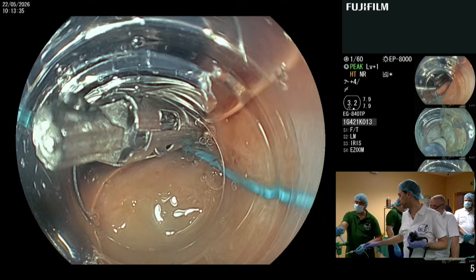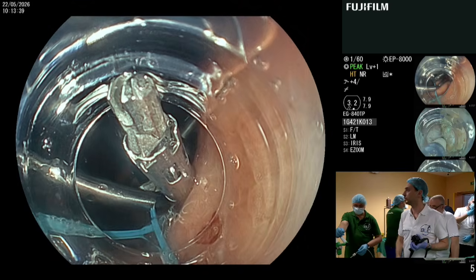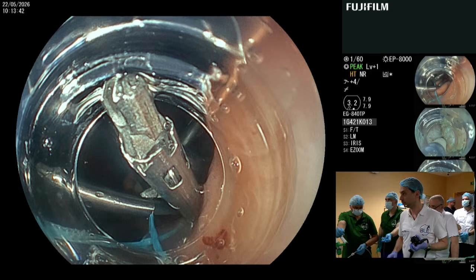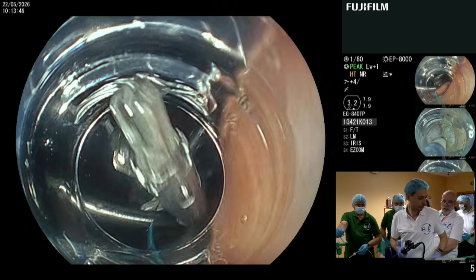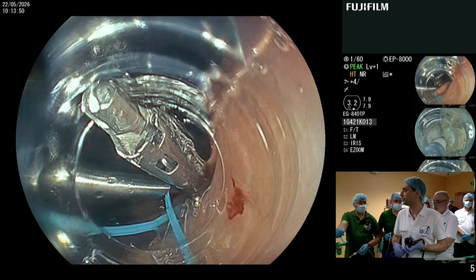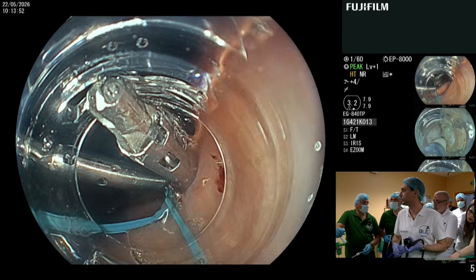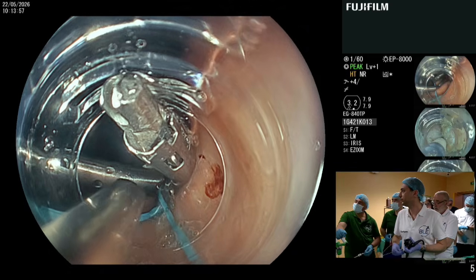And then you first close, and then you tighten it. And then we have to, the abdomen is very soft, is soft, but yes. Probably we don't need puncture. Okay, open.